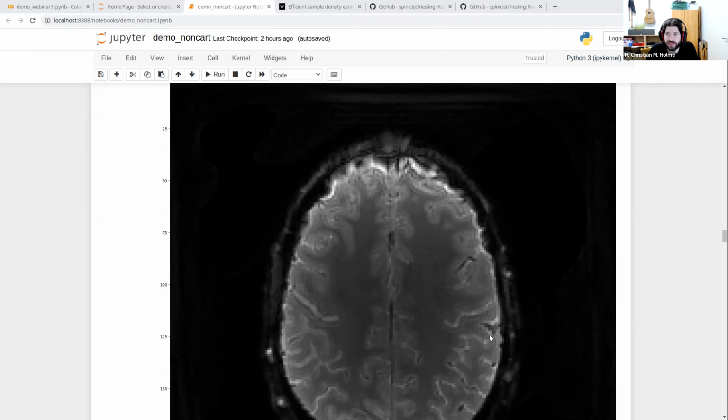If you have some parts of your data that look radial, I'm not sure what exactly your spirals look like, you might be able to use them as well. Yeah, my initial part looks like radial, right? Yeah. If it looks like that, then you could just try to run this gradient delay estimation on that.